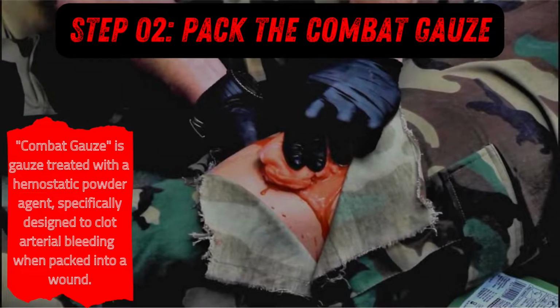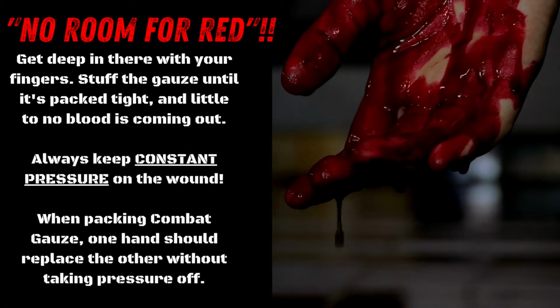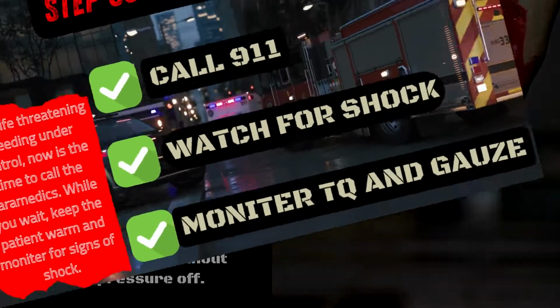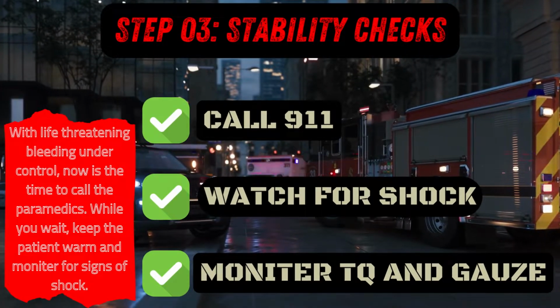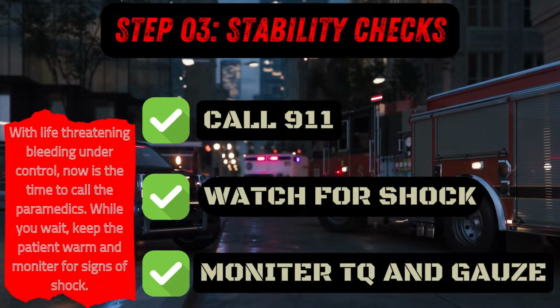The next step is to pack the wound tight with a special gauze that is specifically designed to clot blood. Okay, this part can get a little messy, but it has to be. It's super important to keep constant pressure on the wound while you're packing combat gauze so no blood can spill out. Okay, the only thing left to do here is to call 911, watch for signs of shock, and monitor your blood stoppers until help arrives.